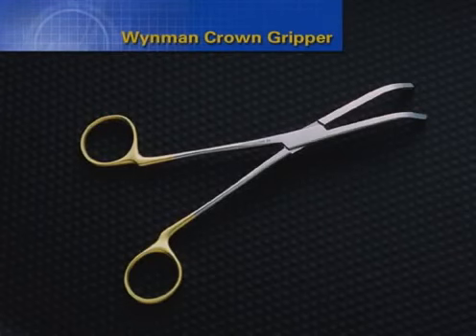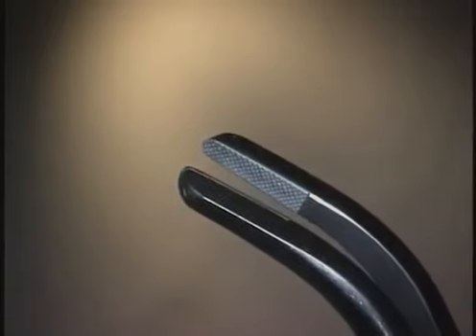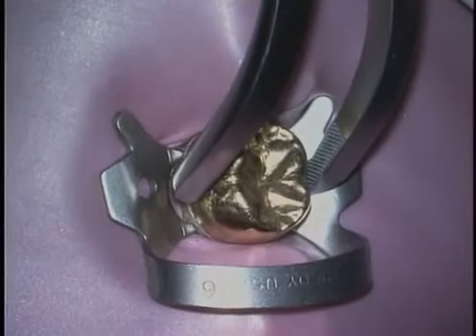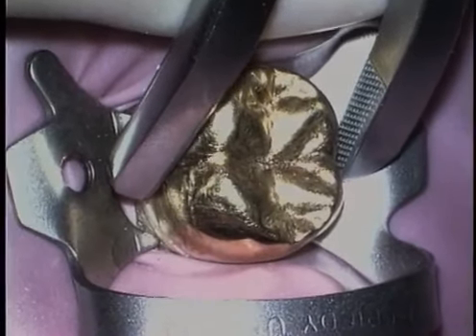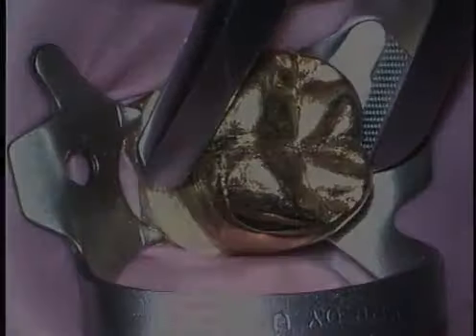The Wynman Crown Gripper is designed to remove provisional crowns and metal castings that are temporarily cemented. This instrument is powerfully constructed to provide a superb grip. The working end of the Wynman Crown Gripper is ergonomically curved to facilitate access and has tungsten carbide inserts. Place the Wynman Crown Gripper below the height of contour. Place an index finger just anterior to the crown to be removed and fulcrum off the finger. Subtle buccal lingual rocking motions generally remove the crown.